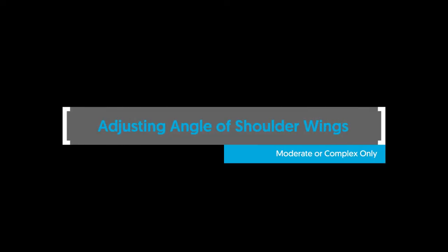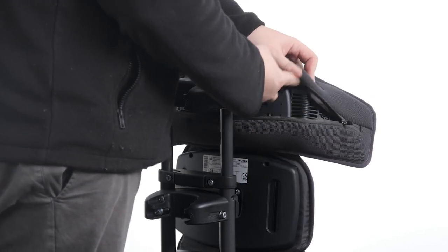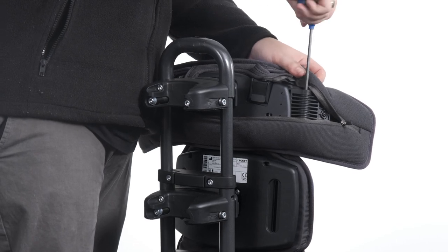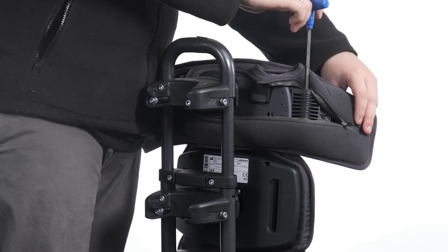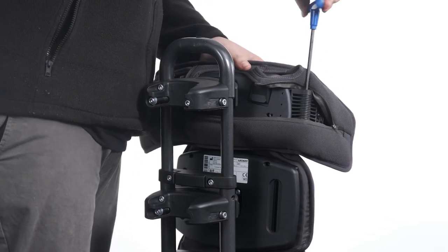Adjusting angle of shoulder wings — moderate or complex only. To adjust the angle of shoulder wings, unzip the cover on both sides to access the adjustment bolt from above. Loosen the bolt and move the shoulder wing to the desired position. Tighten the bolt to secure in position and zip up the cover.